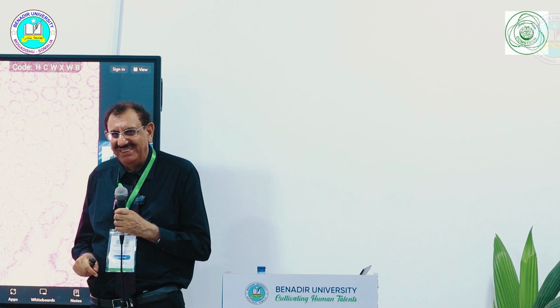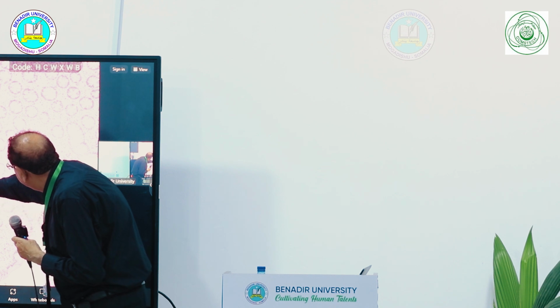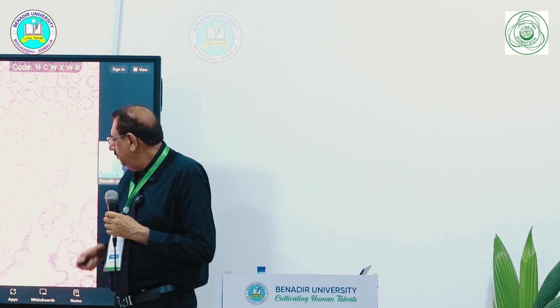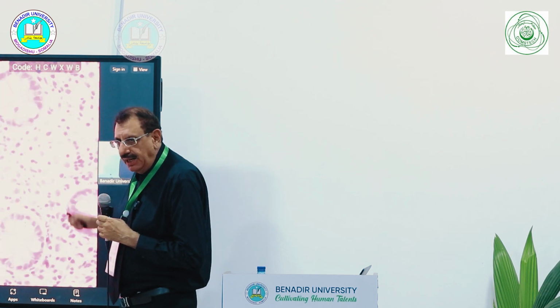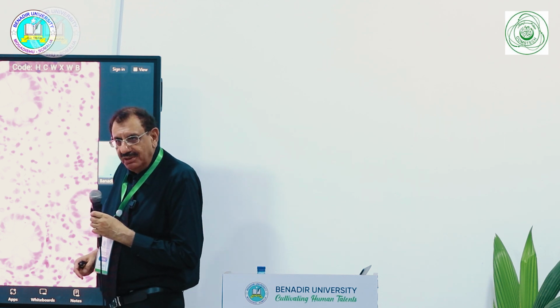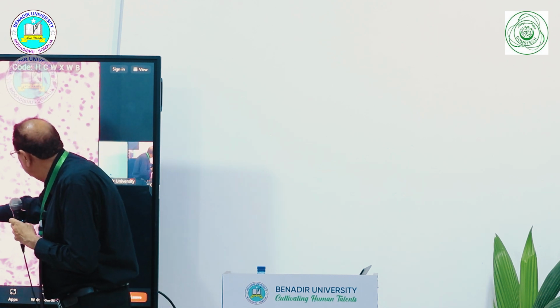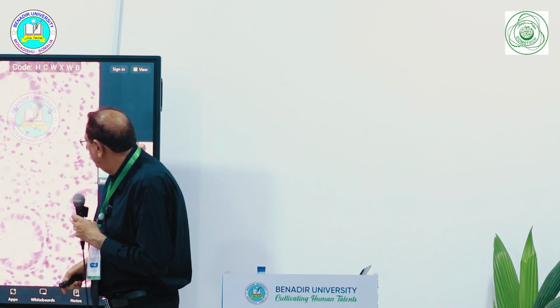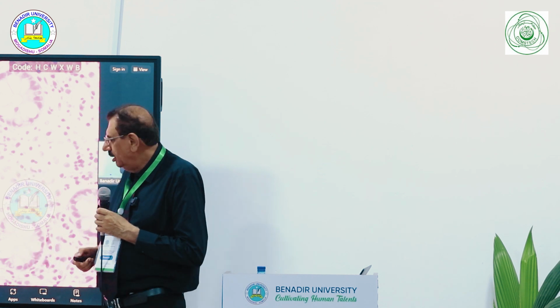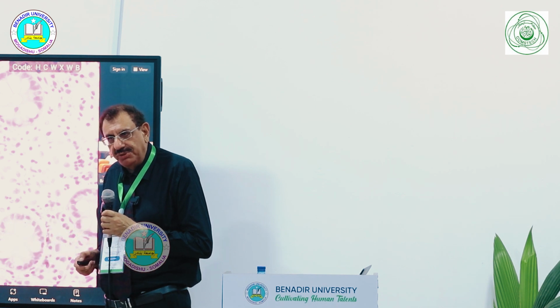Next case. But because there was some history and there were some expansion there, I said, just get some immuno. This is the higher magnification. And here I think you may see some large atypical cells, isn't it? These ones. They look as if some tumor is infiltrating. They are not typically looking like signet ring carcinoma. So what could this be?